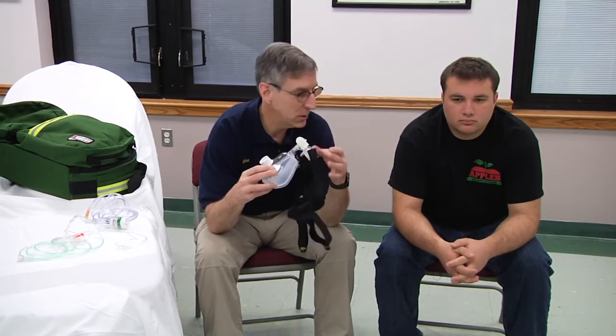So we're going to set up this CPAP, and then I want to talk about the 2 most important things about CPAP. The 2 things you need to keep in mind with CPAP that are critical to it working effectively are selling it to the patient and knowing when to quit, when it's not working. So when we talk about selling it to the patient, we're actually going to talk to the patient about the benefits of solving their difficulty breathing with a device that really sounds somewhat scary.